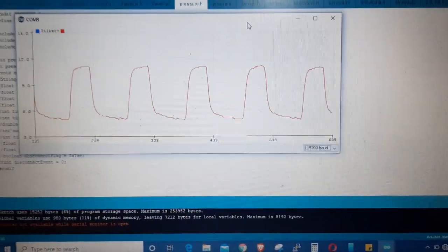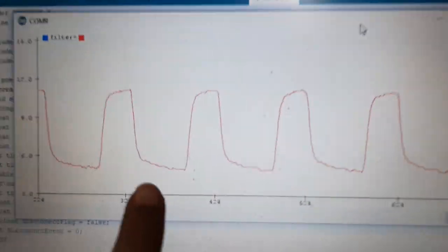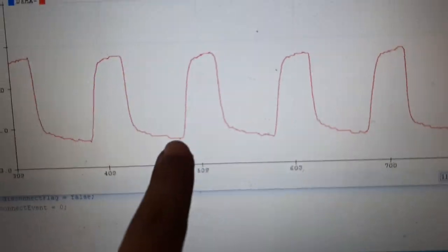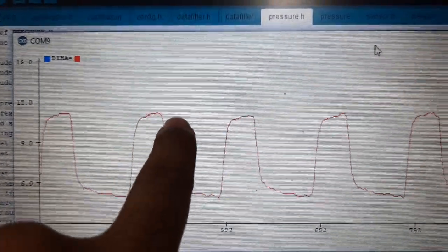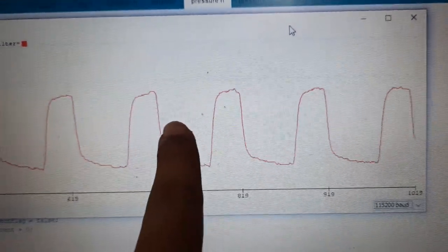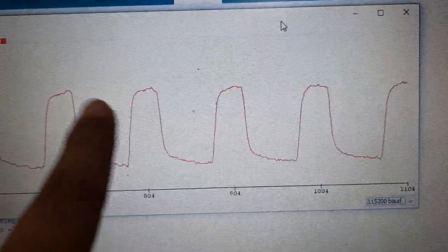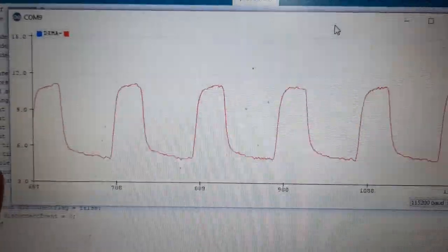So as you can see, this is the pressure support mode of our ventilator, and it's maintaining the PEEP pressure at about 5 centimeters H2O, and this is about 11 centimeters H2O pressure support, and the TI time, inspiratory time, is 1.5 seconds. So this is actually working pretty good.